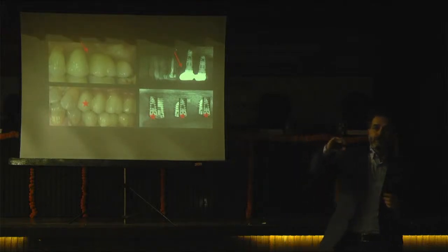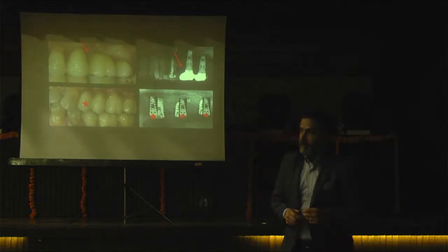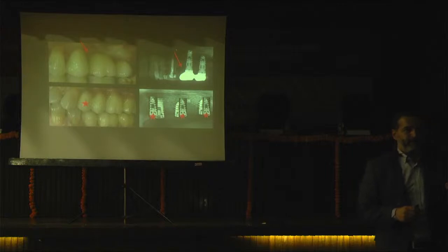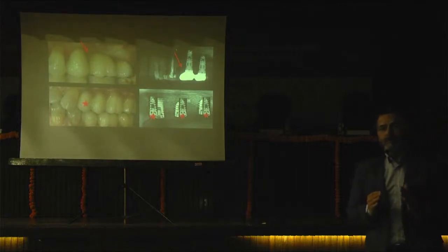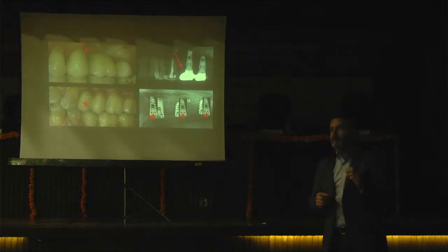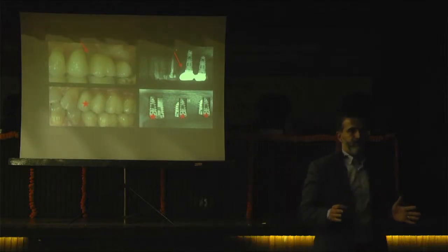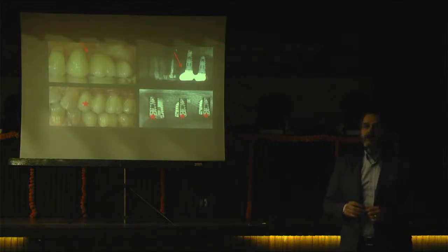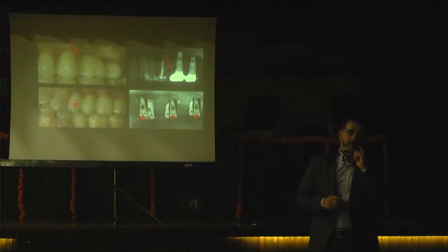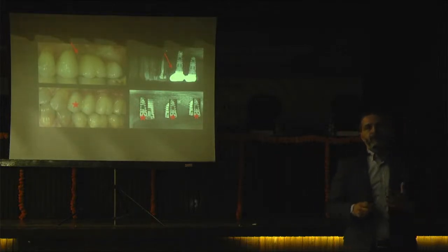And we passed the ocean, but we are in a bad situation, in a little water drop. What is that? The first implant was located in the wrong place, not the right place. So there is a missing part, and we have to compensate for the missing part with the porcelain material. That causes food impaction, and you do so many great surgeries, but the patient is not happy. Why? Because when he or she eats something, there's food stuck over there, okay? You think that you did a great job, but after that, the patient doesn't like it.